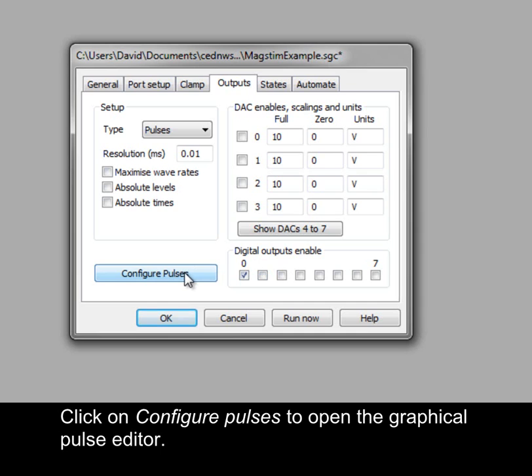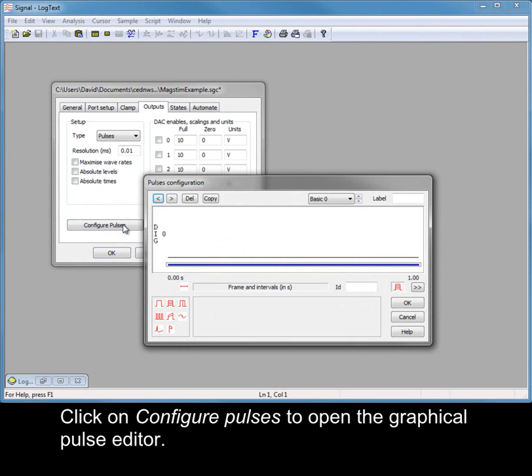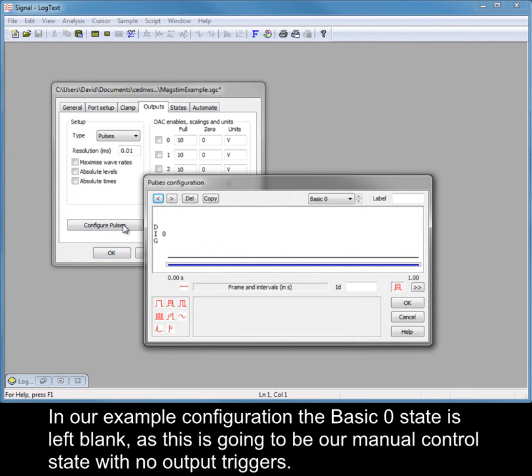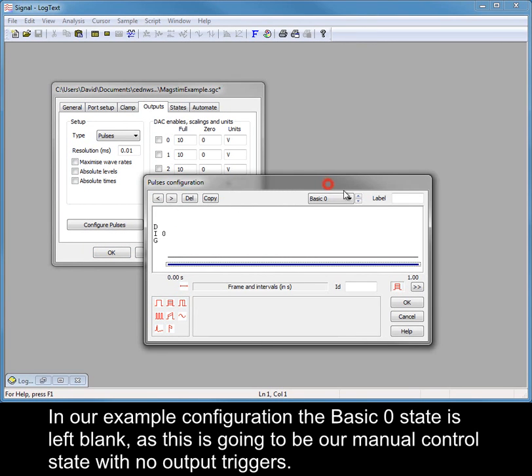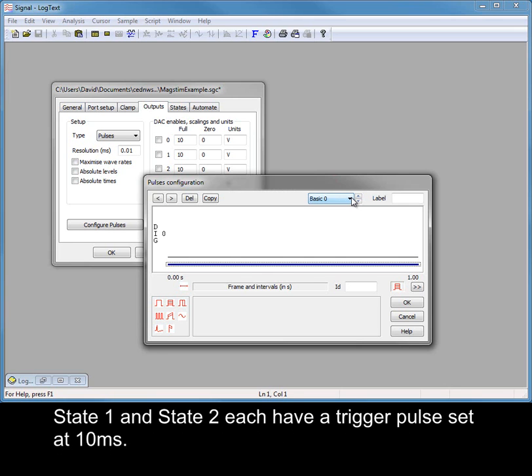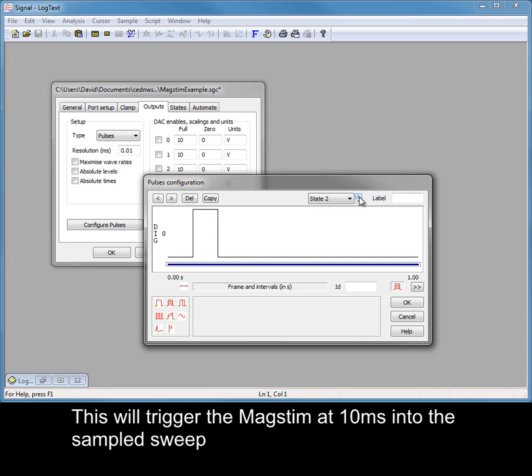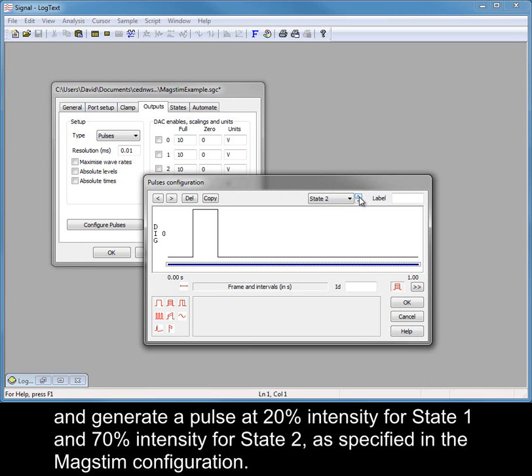Click on Configure Pulses to open the Graphical Pulse Editor. In our example configuration, the basic zero state is left blank as this is going to be our manual control state with no output triggers. State 1 and State 2 each have a trigger pulse set at 10ms. This will trigger the MagStim at 10ms into the sampled sweep and generate a pulse at 20% intensity for State 1 and 70% intensity for State 2, as specified in the MagStim configuration.